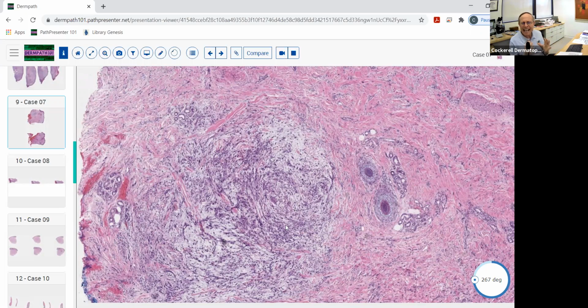It's basically just a gigantic atypical fibroxanthoma that can metastasize and cause more problems than a smaller, rapidly developing, superficially situated atypical fibroxanthoma. So just think of it as a big, deep atypical fibroxanthoma. And years ago, what we used to call those was malignant fibrous histiocytoma, but they decided they don't want to use that name anymore for some reason or another. I actually like that term. It's malignant, it's fibrous, it's fibrohistiocytic. It tells you what the differentiation is. So I think it's a better name than pleomorphic dermal sarcoma, but it's a fad.